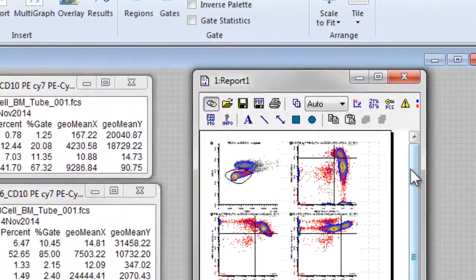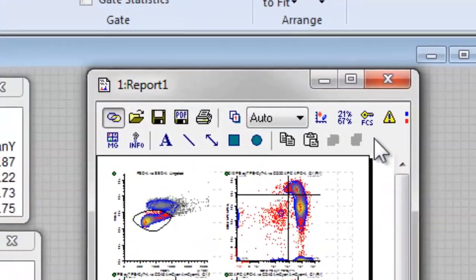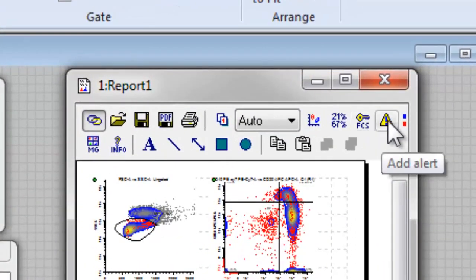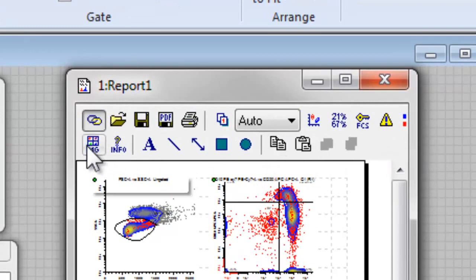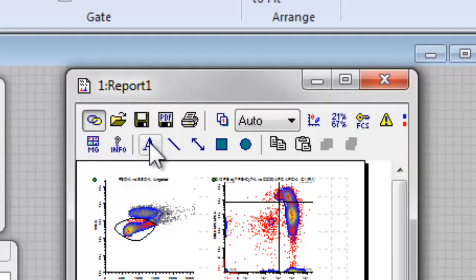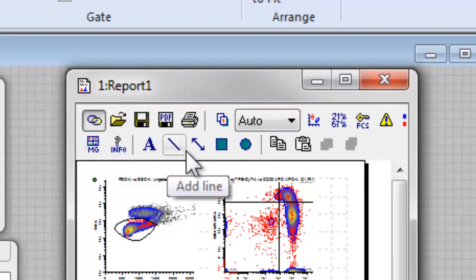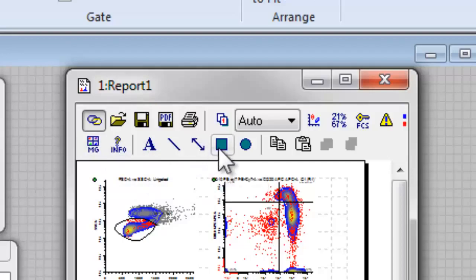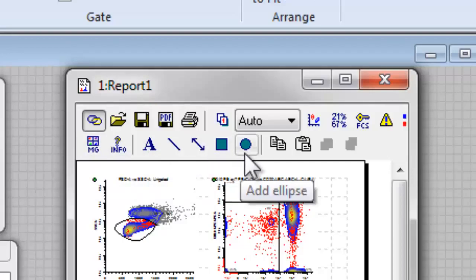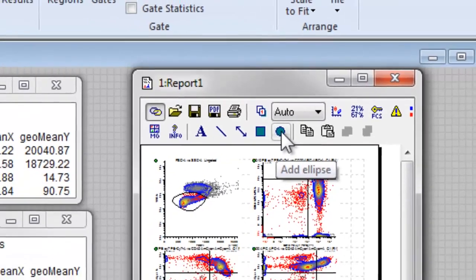We can also add keywords, alerts, multigraphs, text boxes, and various graphics to the report, now or later on to further customize the layout.